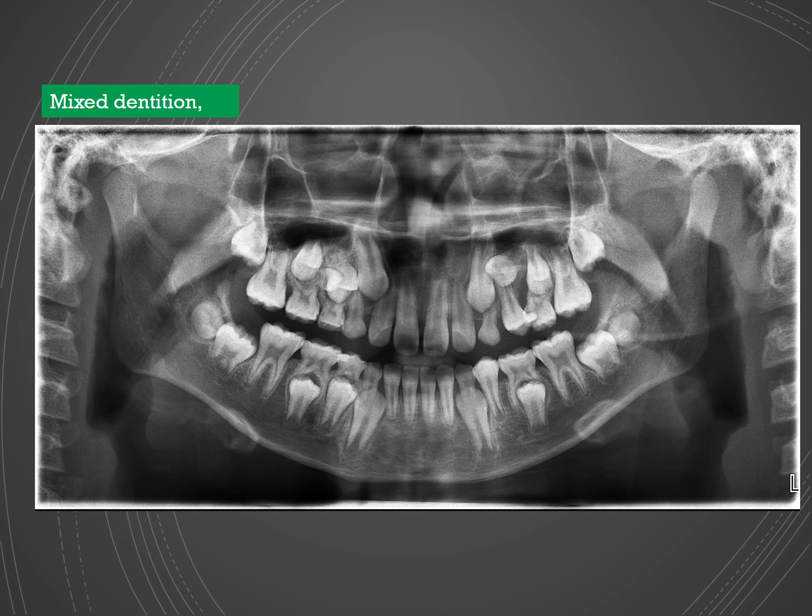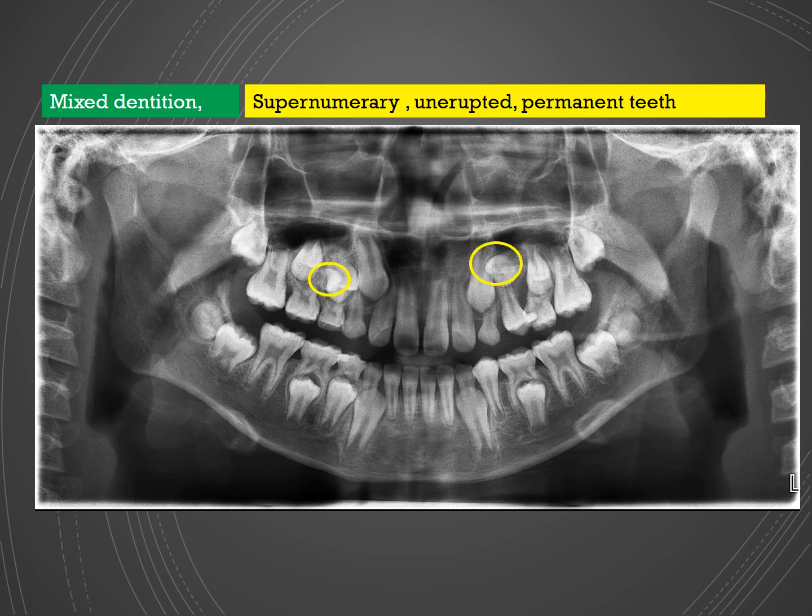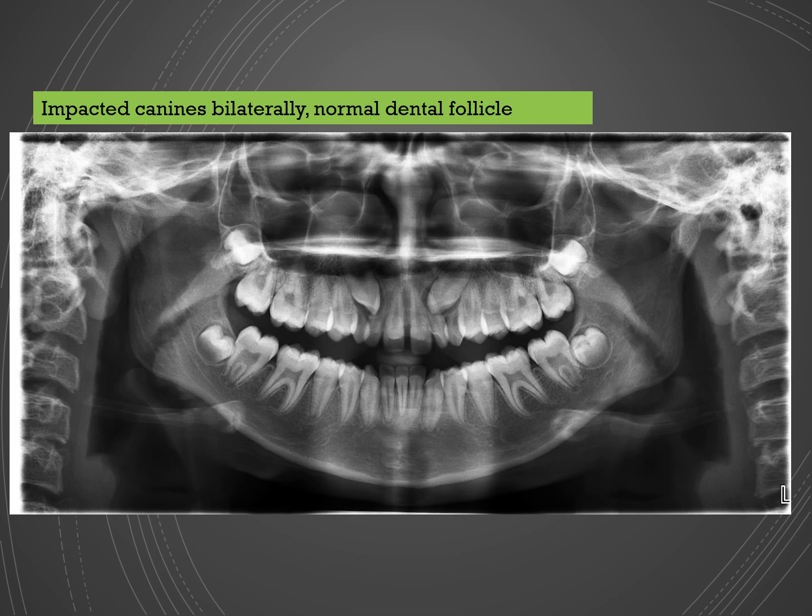teeth are, sorry, the successive teeth are. It also gives you an idea that they could be supernumerary unerupted or unerupted permanent teeth, and helps you analyze what the location of these teeth is. Having said that, children, again, you should be cautious while exposing children to panoramic radiographs.